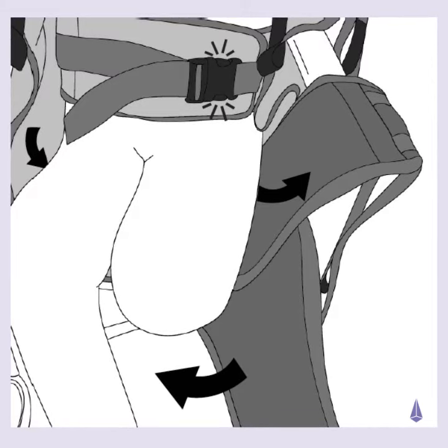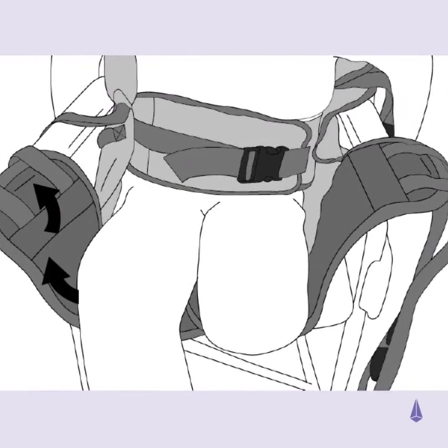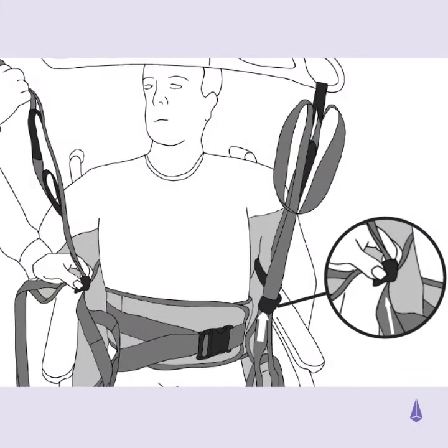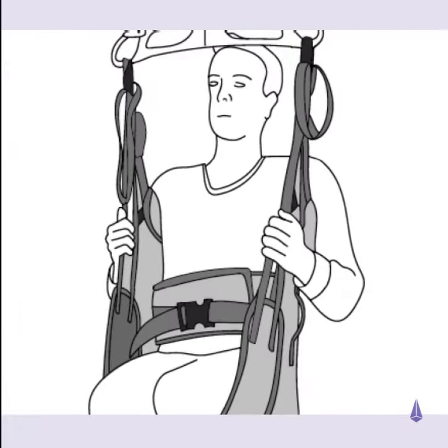Take the first leg paddle and gently glide it under both thighs. Gently feed the second leg section fully underneath the first one. Take each leg section and feed through the guided tape located on each side of the sling.